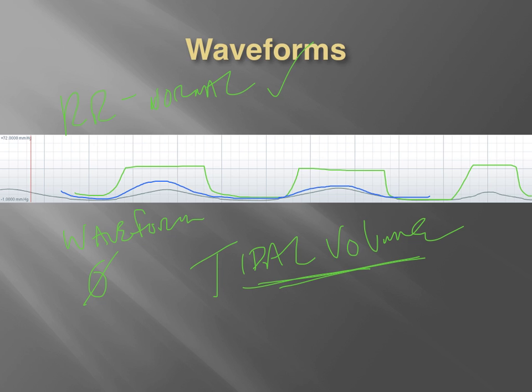However, ventilation and perfusion together match better in the lower aspects of the lungs, which is where the majority of our gas transfer of oxygen and carbon dioxide happens. So this patient, even though there might be good gas transfer of oxygen and carbon dioxide down in the lungs, the gas exhalation of carbon dioxide is inadequate, which is showing this poor reading.